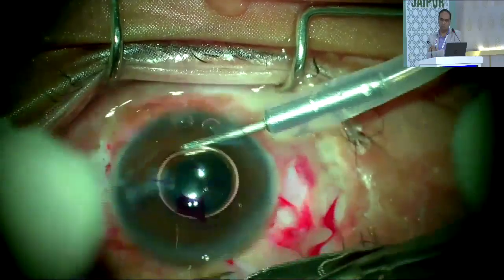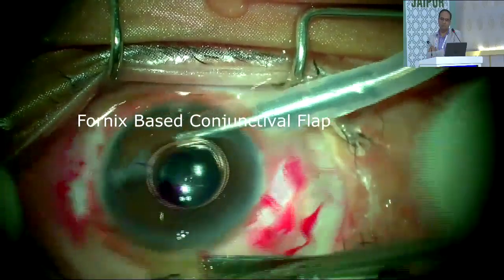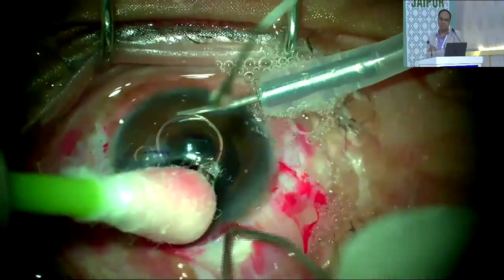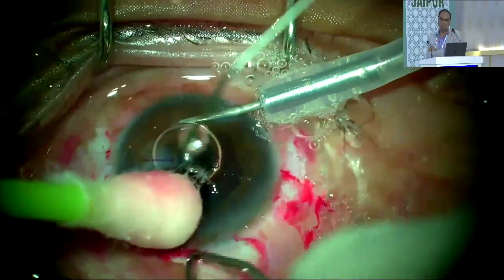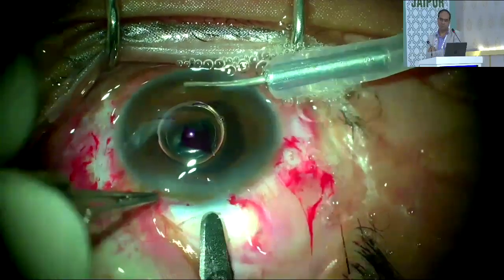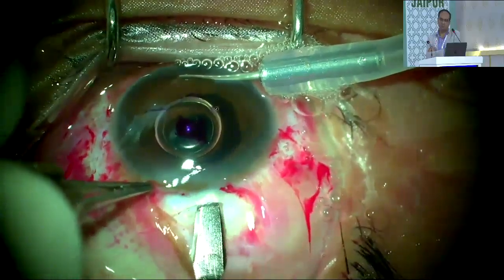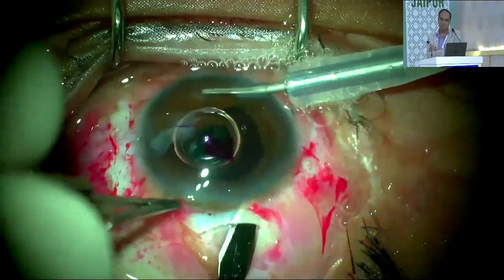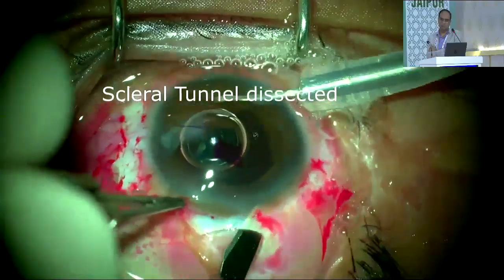Now the next step involves creating a superior fornix based flap. The bleeders are cauterized. Then a scleral incision is made using a number 15 blade and lamellar dissection is done with a crescent blade to construct a triplanar corneoscleral incision.